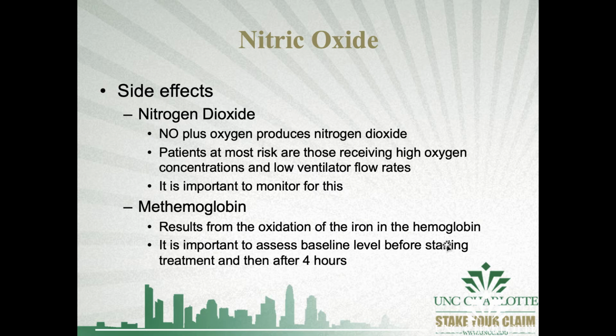delivery, and we're looking at nitrogen dioxide. So nitric oxide will interact with oxygen to develop nitrogen dioxide. Basically, patients who are on high FiO2s are more likely to develop higher levels of nitrogen dioxide. So we have to be aware of that because it is an oxidative and a dangerous molecule in our body, and we should not have that in there. I never really had any issues with that, but it's a readout that you get on your machine and you can monitor for.